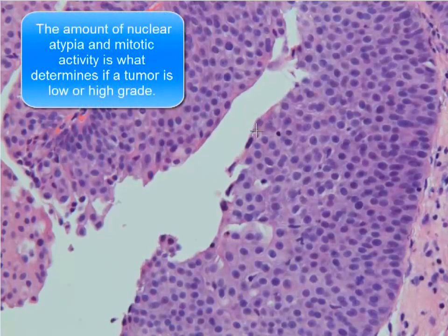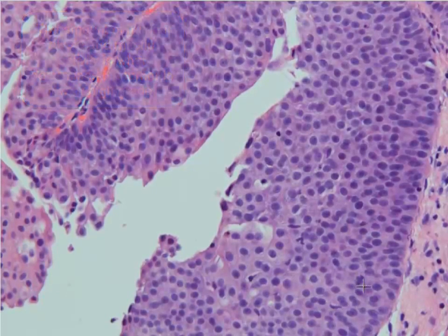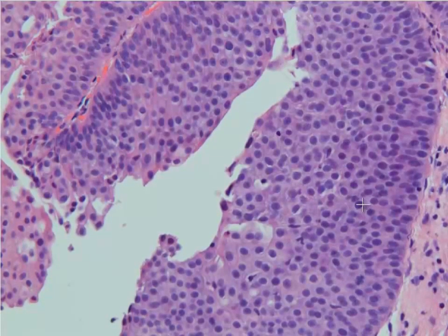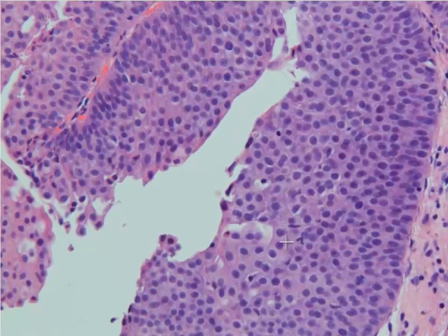You still have these umbrella cells sitting up on top. And here's one mitotic figure in this field. Occasionally you'll see mitotic figures and a little bit of nuclear atypia — meaning that one nucleus is bigger than the one next to it — but these changes are considered mild.